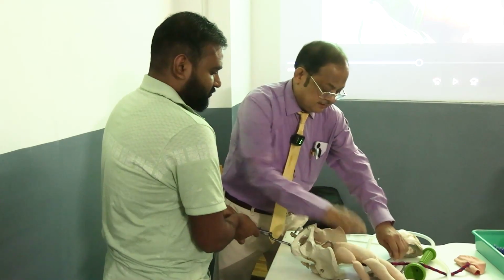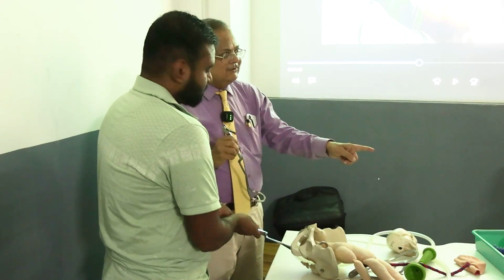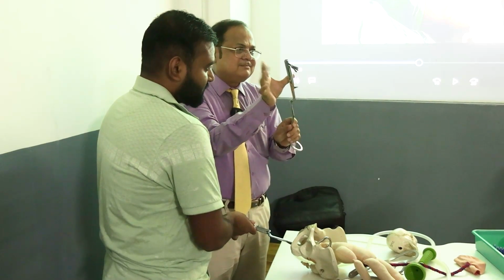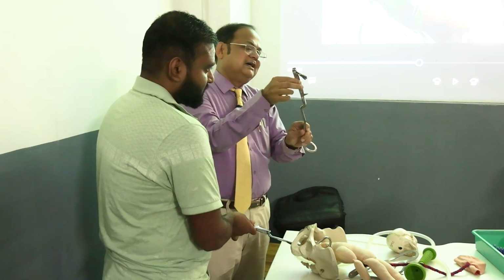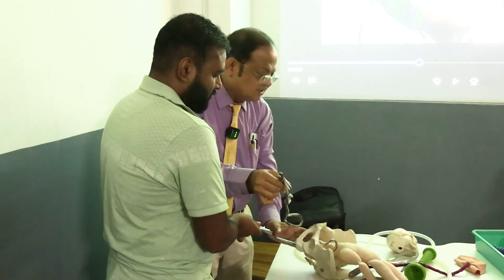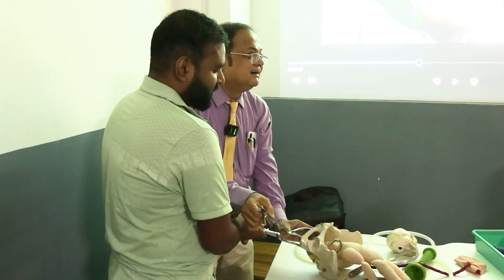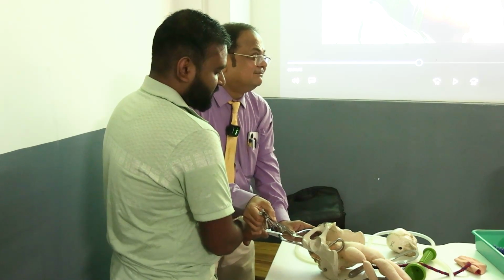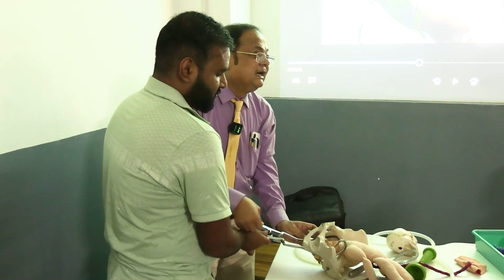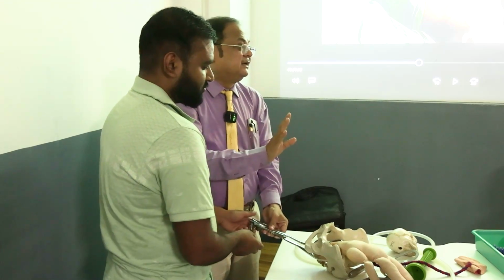And then another is that the left blade is parallel to the right, with thumb, index and middle, just like this. And the left also the forefinger, and will press by the, where you will press? The heel by the left thumb, and the right hand will just guide it. This is the application. And if the rotation is complete, no problem.